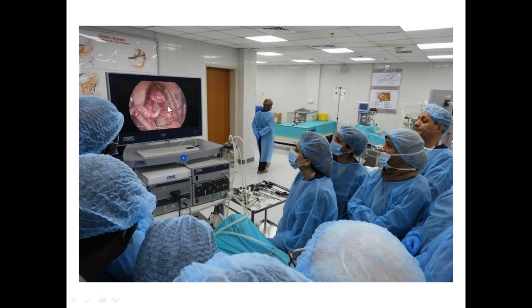Now look at the laparoscopy one. You've got an expensive monitor, a keyboard to control a few things. Then you've got 4 or 5 instruments which are going to be aiding. And look at those long, sleek instruments. These are laparoscopy instruments, which are going to help you perform your activity after you put in something like ports. So what you actually do is you create a hole, a small cut into the skin, and then you take a tube-like thing through which these slender 5 or 10 millimeter instruments are going to be passing.